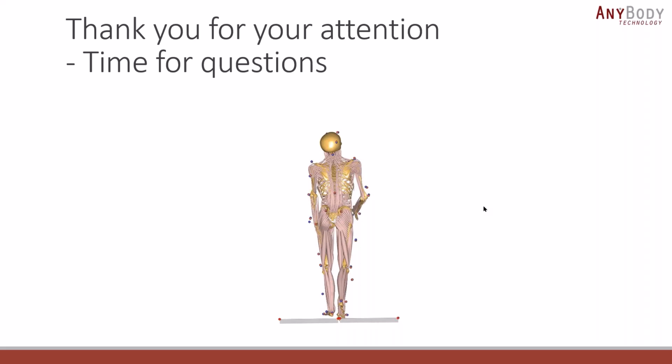Yes, exactly. Well, we did not use the built-in optimization routine in AnyBody, but AnyBody was actually one of the main components of our optimization, as you can imagine. So we built our own optimization. For running the models, the optimization routine calls the AnyBody software, so it can simulate the model with different implant positions and compare the results. So we find the curvatures of the implanted case that best reproduce, as closely as possible, of course, the pre-diseased biomechanical situation.